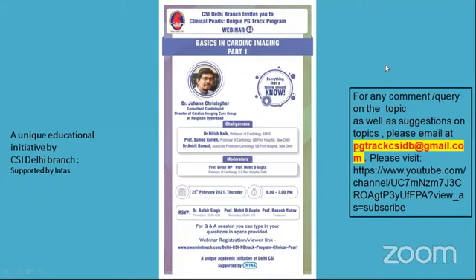Because it does not involve contrast, it can be done in 5 minutes. I do it in 5 minutes. So for a lot of the patients who are socially disadvantaged, I do a lot of MRIs at a very nominal cost, and we get a very good index of the iron levels in their heart and help them through the Thalassemia Society of India, with whom we have had a good partnership for the last decade.